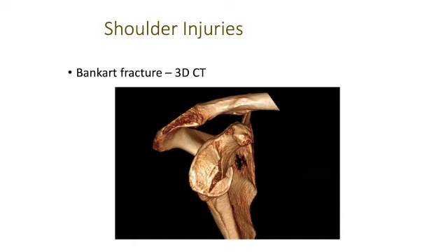So what we have here is a Bankart fracture again. Obviously you can definitely see the detail. This can become very crucial information to know, because if we are a surgeon who needs to go in and know exactly what procedure we need to do, this is probably going to give you one of the best images that you can ask for without actually going in through an invasive procedure like a surgery.